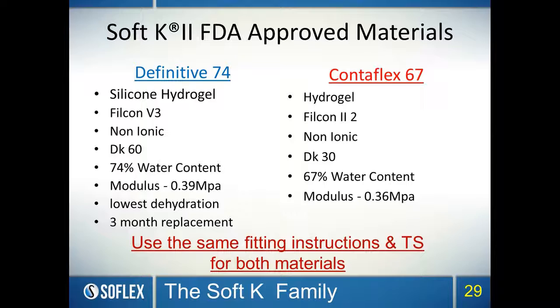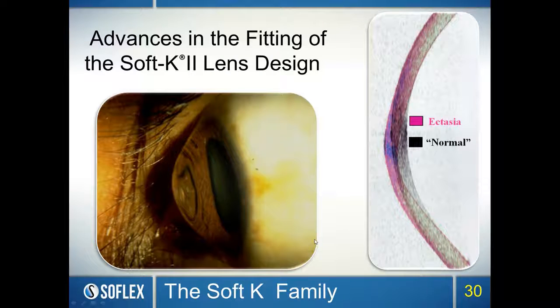The two materials we manufacture are both FDA approved: the Definitive 74, which is a silicone hydrogel material, and the Contaflex 67%, which is a hydrogel material. Both materials have about the same modulus. You should use the same fitting instruction and trial set for both materials.